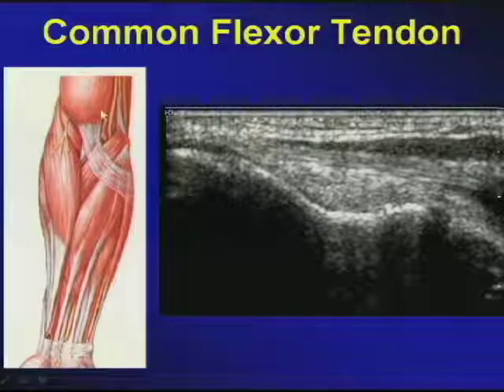So, from the colored Netter drawing, we're going to swing over to the grayscale imaging of ultrasound, where you see the apex of the epitrochlea, the downsloping and crevice of the ulnar notch, along with the joint space, and finally the coronoid process. Above that, now you see some connective tissue, and then the fibrillar pattern of the conjoint tendon of the flexors into the common insertion into the epitrochlea, accompanied by the multipennate structure of their muscles.